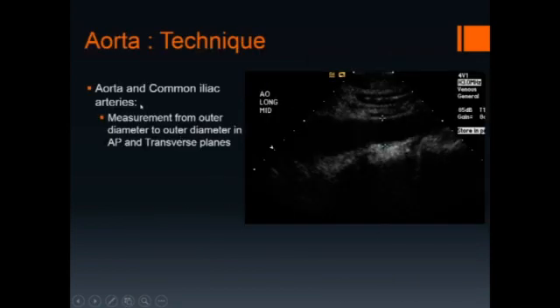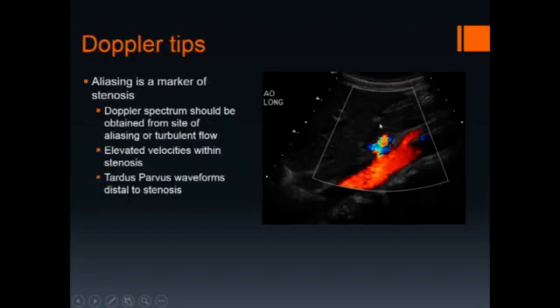Technique. Measure the aorta and common iliac arteries from the outer diameter in the AP and transverse planes. Doppler tips: aliasing is a marker of stenosis. The Doppler spectrum should be obtained from the site of aliasing or turbulent flow.